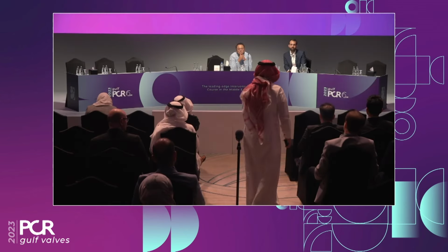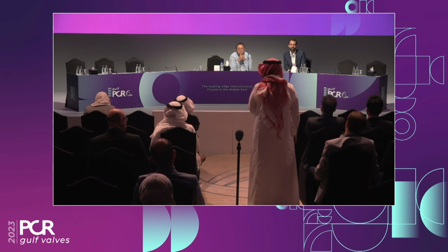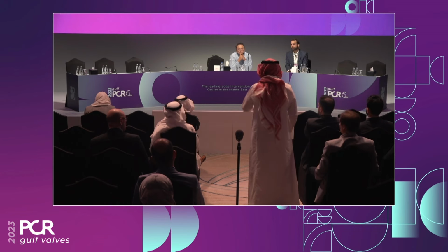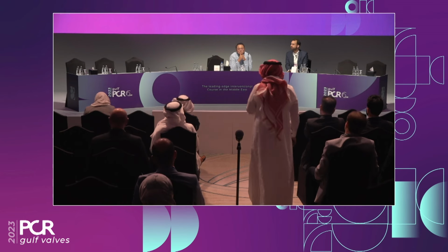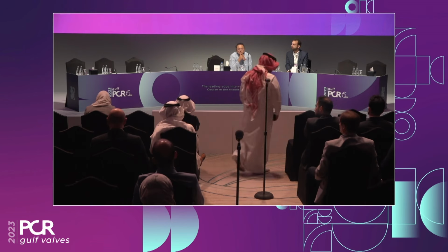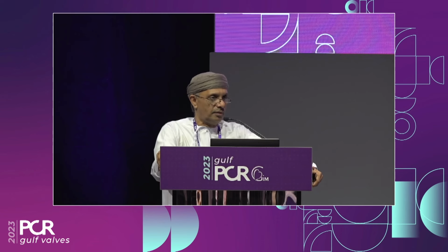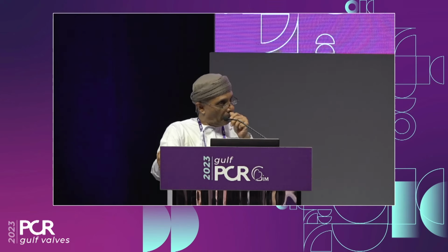Okay. I'm still following up on Dr. Faisal's question. What would be the ideal patient that you would recommend this valve to? As Dr. Weil mentioned, you prescribe the right valve for the right patient. Can you list that for us? Tortuous aortas where it was really difficult to pass other systems, or you had to use a very stiff wire just to get your valve up. So very tortuous aorta, horizontal aorta. This is what I would think of. But as Dr. Ghazal said, it's a very user-friendly system.